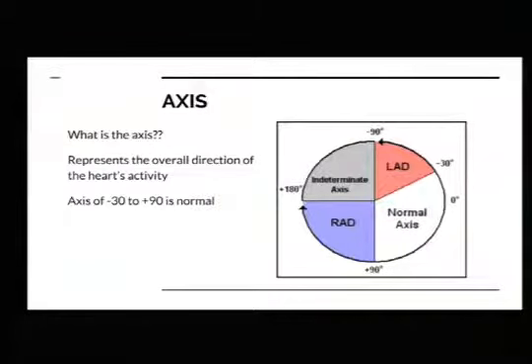So axis, the dreaded axis. Like I said, I'm not asking you guys to calculate axis in every patient, but at least when it reads out left axis deviation, right axis deviation, or indeterminate axis, you need to know what that means. Do you have your leads on right? Kind of the safety check on that.